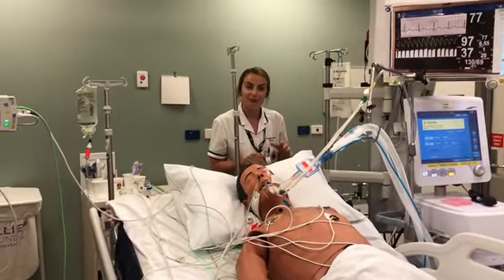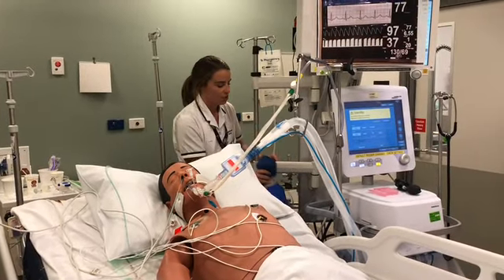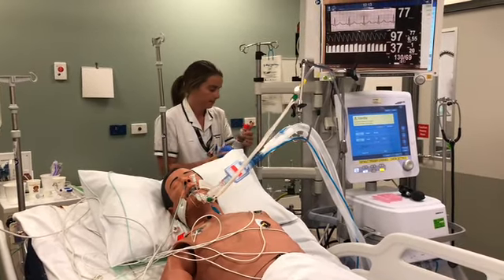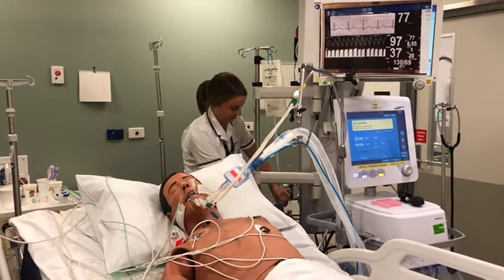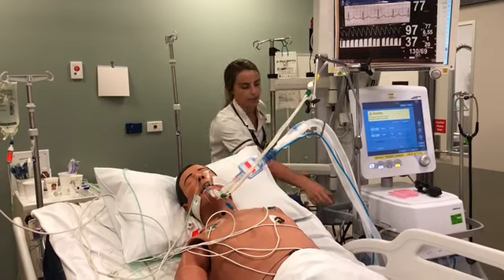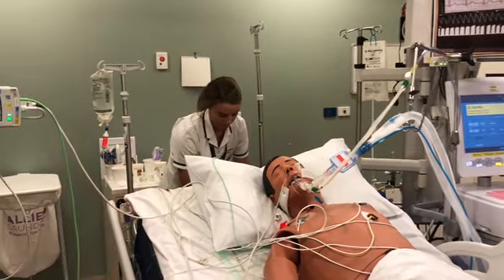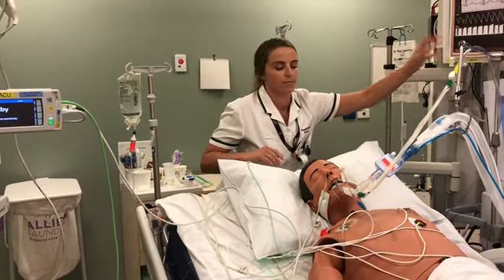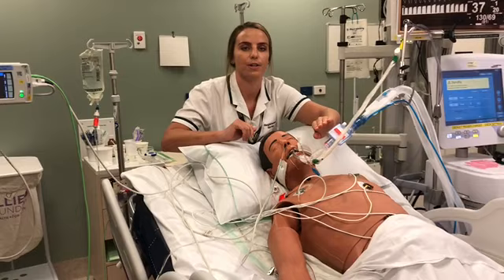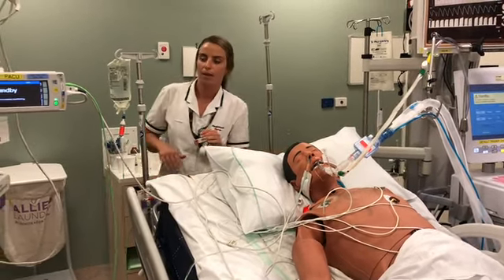Moving around to the back of the bed space, same as our normal safety checks. Checking your ambi bag, and your suction, oxygen tank, zeroing your end tidal CO2, your arterial line and your CVP.